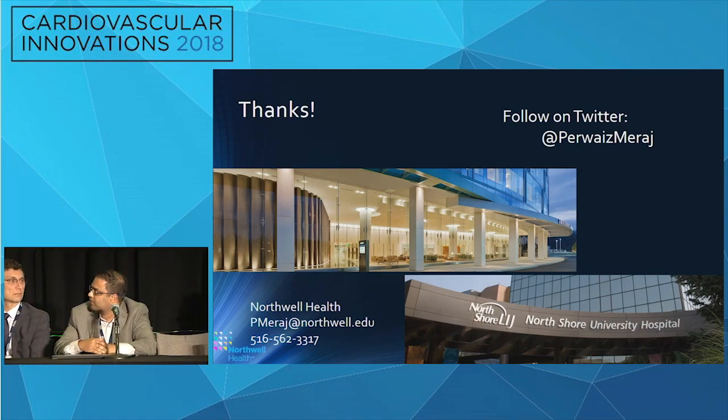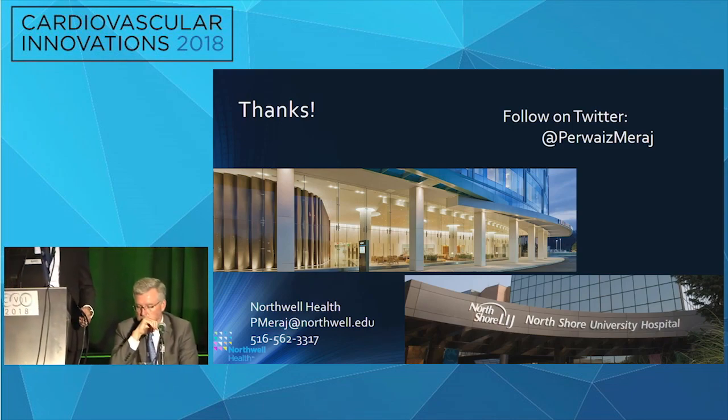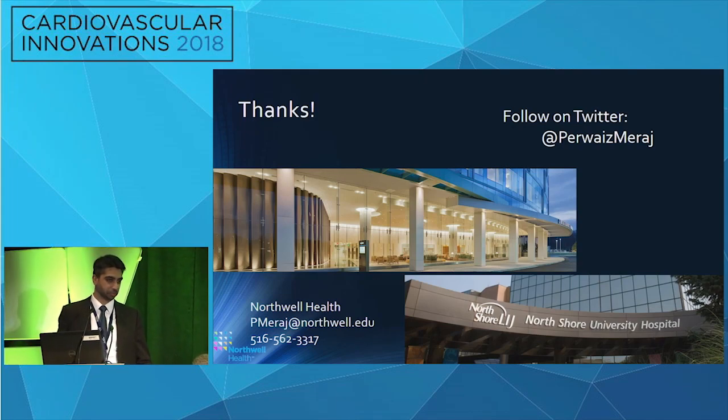We use aminophylline 5 milligrams per kilogram about 5 minutes before we start atherectomy. So for our rotational cases, we are doing that now. In all honesty, in that paper I presented to you earlier, we have seen less than 1% activation of pacemakers with orbital in the RCA. It's probably something to do with the mechanism of how it works. It's the only explanation I have, because the same RCAs, if you roto versus you do orbital atherectomy, you definitely see a difference in terms of heart block.